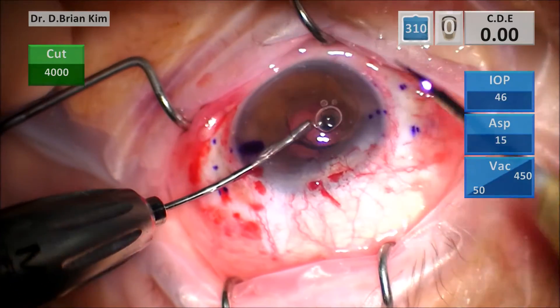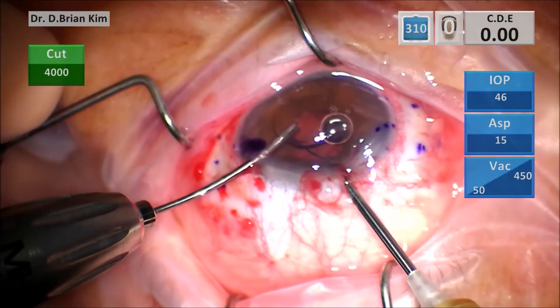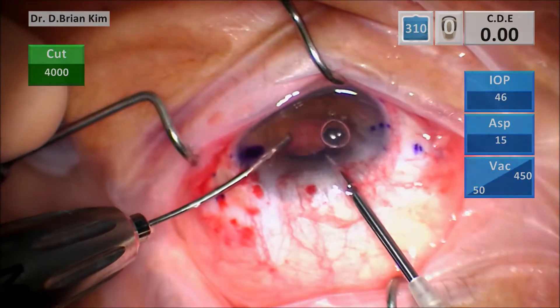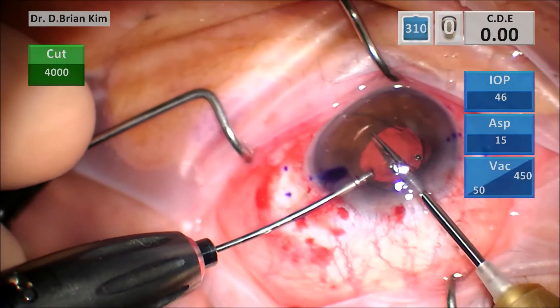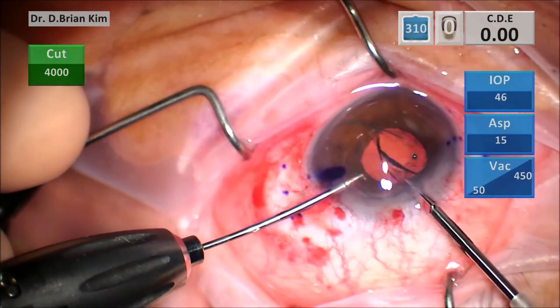Here I'm having some difficulty grabbing the lens. The lens is rotated downward because the patient was blocked and the eye was just rotated in a funny way. In retrospect I should have put in a traction suture to keep the eye more level, and that will be something I'll have to remember next time.